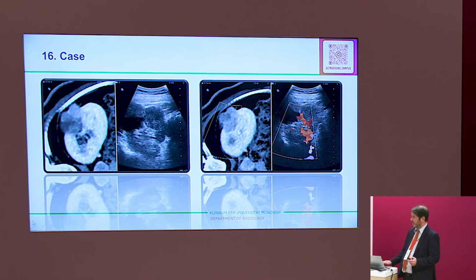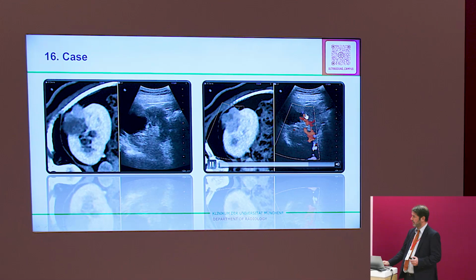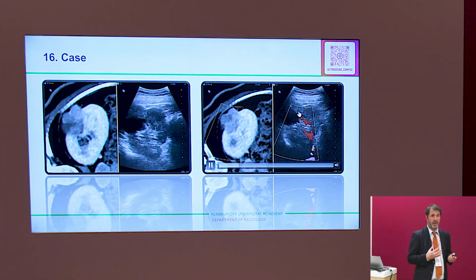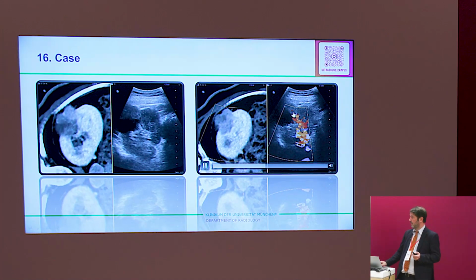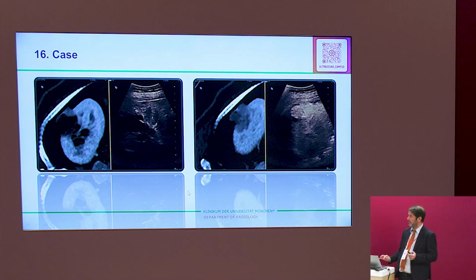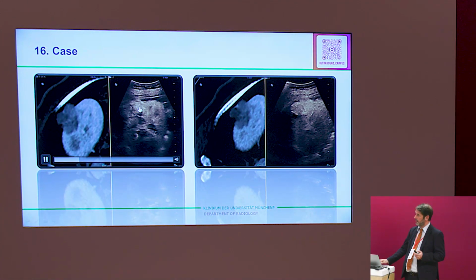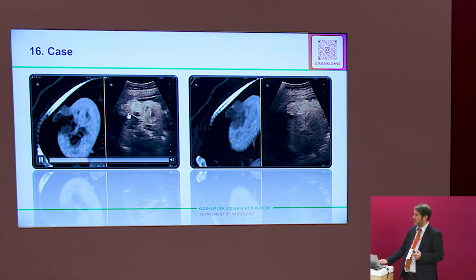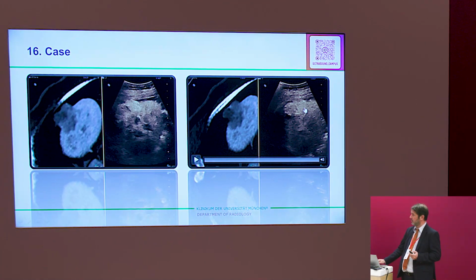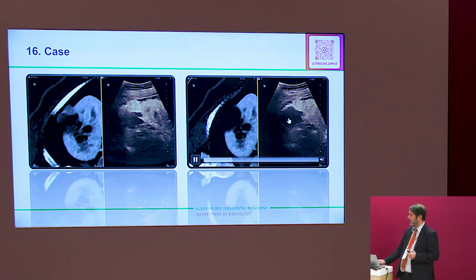So we look for vascularization. This already shows you some vascularization because you see there are some red dots inside. It must be something which is alive. This lesion is dark or black. Then we inject contrast. You see this lesion shows a strong uptake. This lesion just adjacent is dark. This lesion shows wash out. This area is dark.